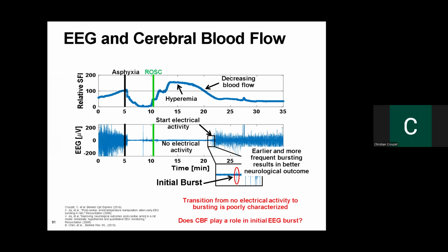Typically more the eye safety than the skin safety because it's a fairly diffuse sample that we're illuminating. Some of the finger clip devices, you can get away with just a few milliwatts. If you're trying to do really long distances, for example, then you need a higher power laser. So we would typically go to like 100 or 150, but our beam is coming out really fast, so it's a fairly large field of view with a low irradiance over the entire field of view.